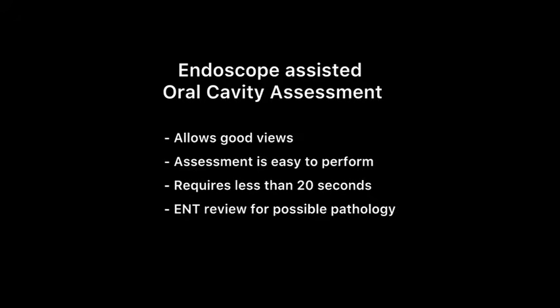Endoscope-assisted oral cavity assessment allows for good views. Assessment is easy to perform, requires less than 20 seconds, and can pick up pathology for ENT review. Now we will demonstrate oral cavity anatomy.